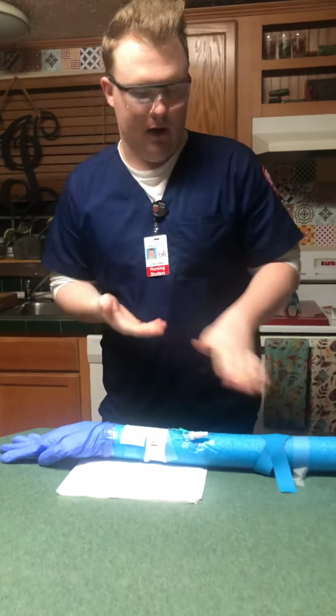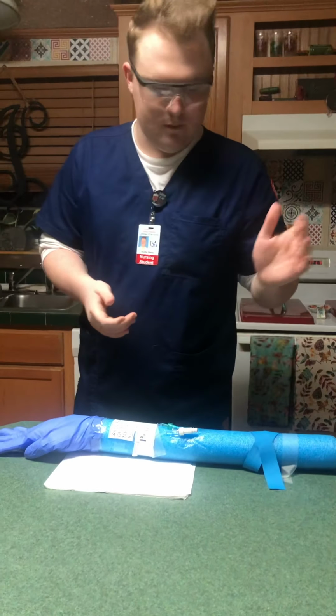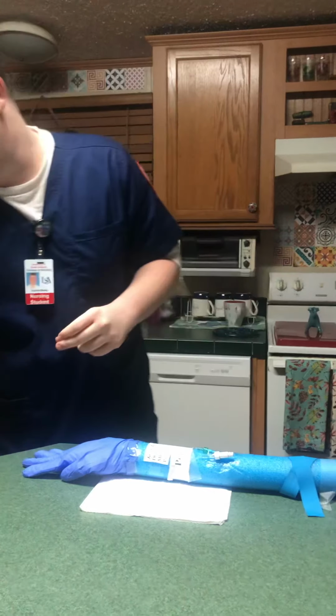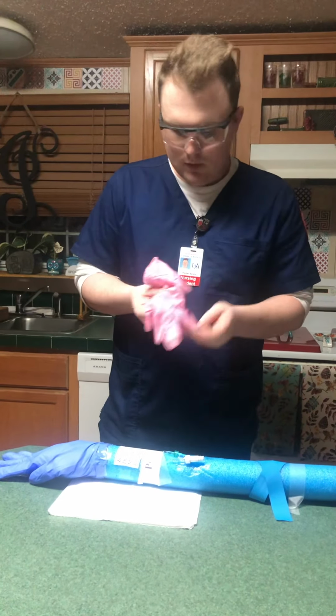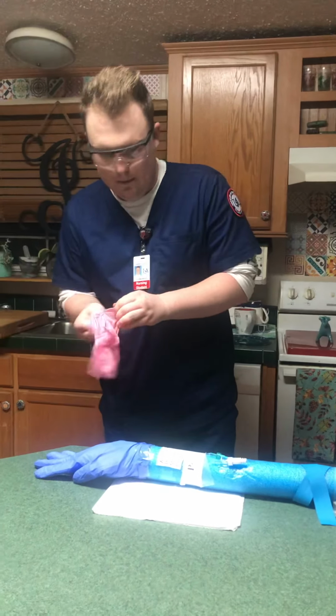Okay, so now the time has come that the physician has ordered for me to discontinue the IV. So I would come in and perform hand hygiene, and obviously the tourniquet would not be on, but I would perform hand hygiene, and I'm going to don my clean gloves.